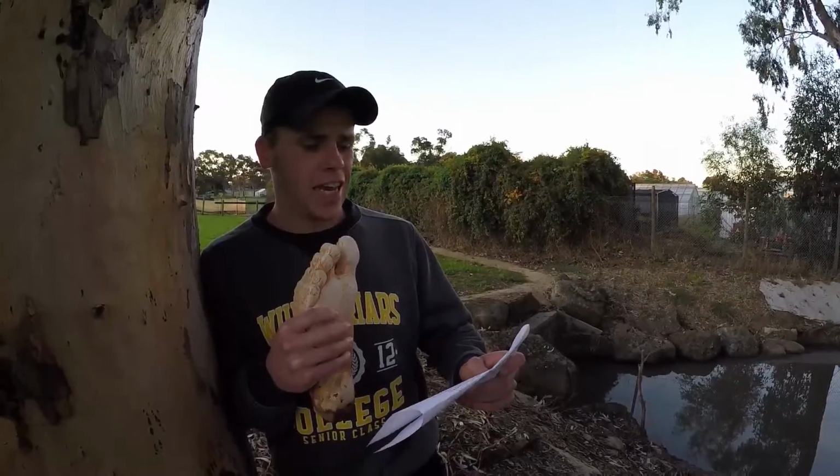@MRIFanatic asked, is MRI suitable for the everyday patient? Prior to its use, a thorough interview of the patient will need to be conducted, as metallic objects such as cardiac pacemakers should not be subjected to the strong magnetic field. Claustrophobia may also be experienced by a patient and can contraindicate its use. The patient should be advised about the cost of the treatment, as they may not be able to afford or be willing to pay for this modality.